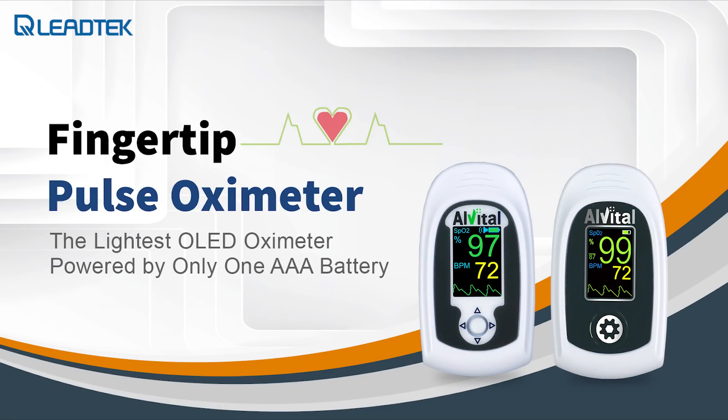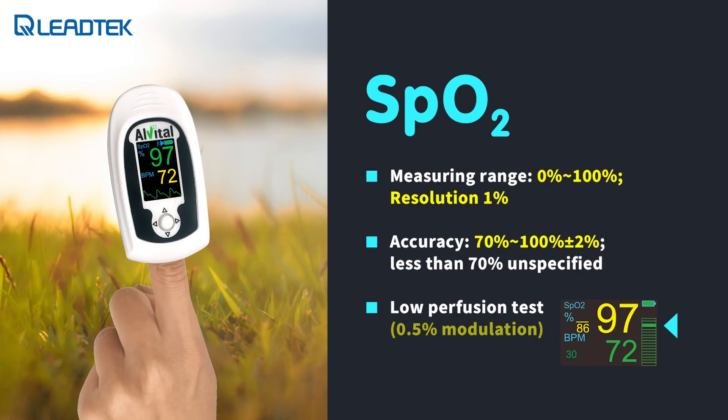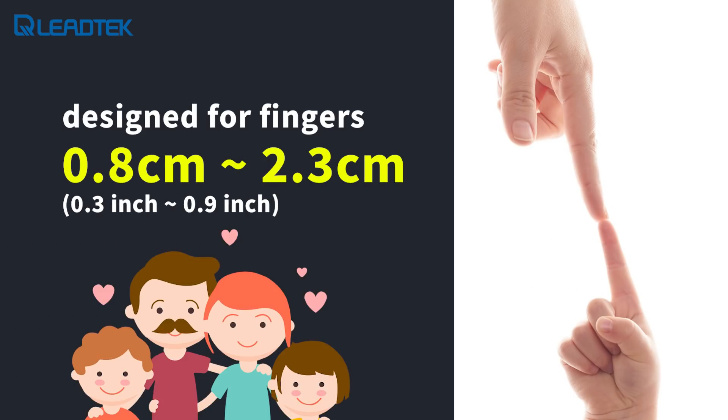The AlVital AT101 fingertip pulse oximeter is a very convenient all-in-one device that measures oxygen saturation and pulse rate. The AT101 oximeter is intended for measuring the functional oxygen saturation of arterial hemoglobin, or SpO2, as well as the pulse rate. It is usable for both adults and children, and can be used for non-invasive spot checking and continuous monitoring of hemoglobin.